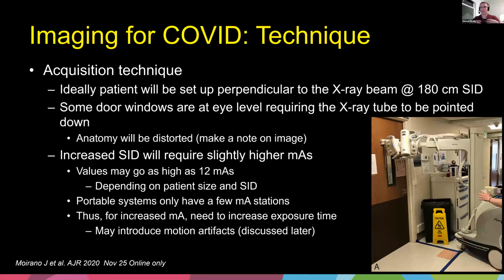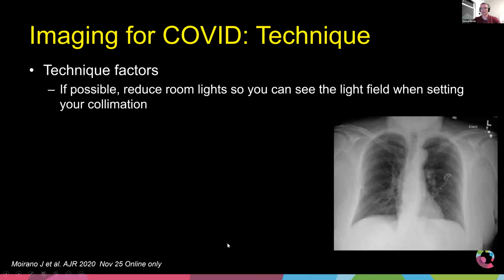If the people are sick and they can't stand as well, or even if you sit here perfectly for a minute or two, you'll just kind of fidget. People just don't normally sit still for a very long time. And so the longer the exposure time, the greater chance for motion artifacts. And unfortunately, there's just not a lot we can do about that.